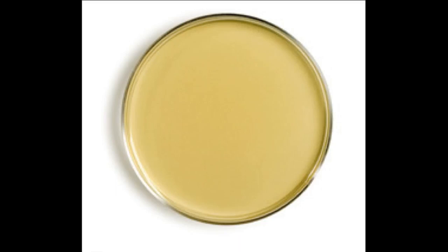After depyrogenation, the test material did not contain any viable microorganisms after 14 days incubation and hence meets the requirements of sterility. The test material has passed the sterility test. Packaging under class 10,000 clean room environment. Implants transfer to the class 10,000 clean room through a dynamic pass box.